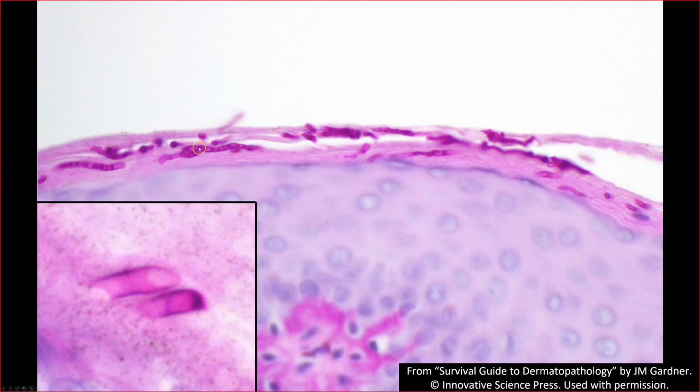But you can see the little septate hyphae, and they tend to run parallel to the skin surface, whereas other things like Candida tend to kind of dive down. Dermatophytes tend to kind of surf across the waves. I stole that from someone else, but I'm not actually sure who it is. I feel like it's something Dirk Elston would say, but I can't remember if I've ever found proof of that.